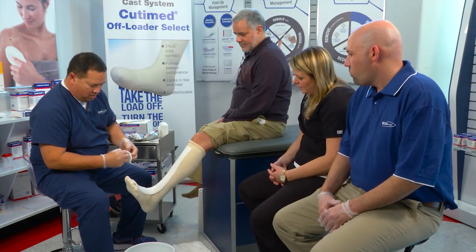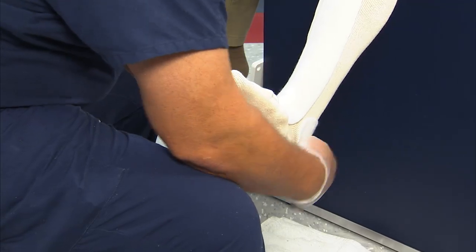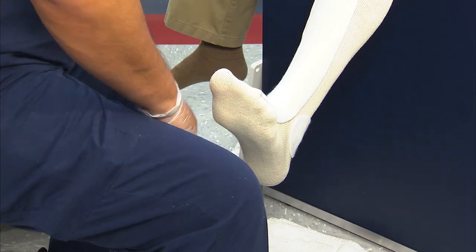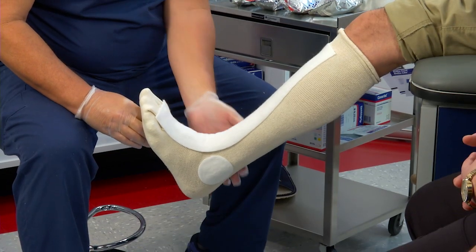I'd like to take these self-adhesive pads for the malleolus, attach that over the bony prominence without overlapping it onto the other felt. Place one on the medial side, again not overlapping on the felt.